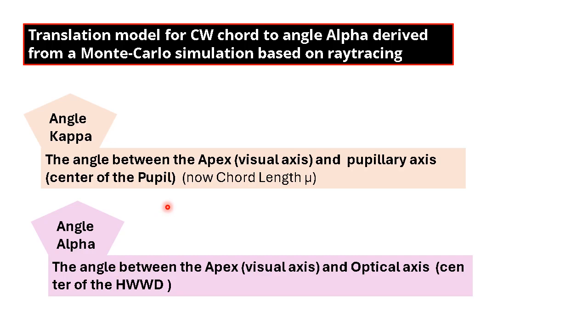However, in the Scheimpflug-based topographers like the Pentacam, it measures the distance exactly at the level of the iris plane. So the measurement is very precise. Normally, the chord mu is around 0.2 millimeter, and a value of more than 0.4 is regarded as abnormal. And when I say abnormal, it means that you should not go for premium lenses or diffractive lenses.